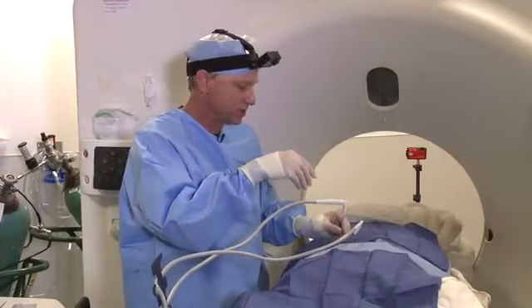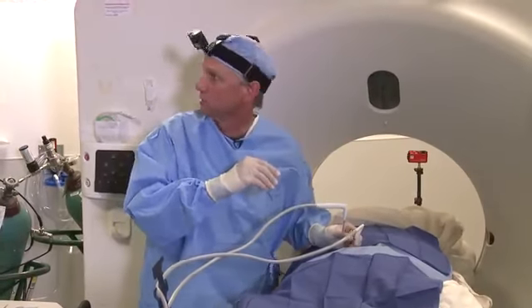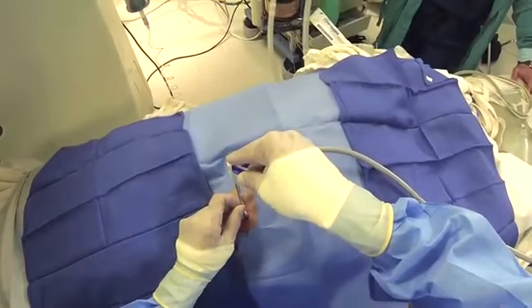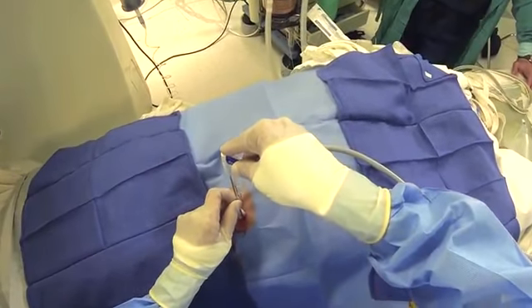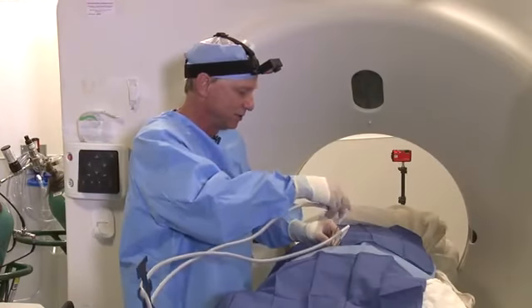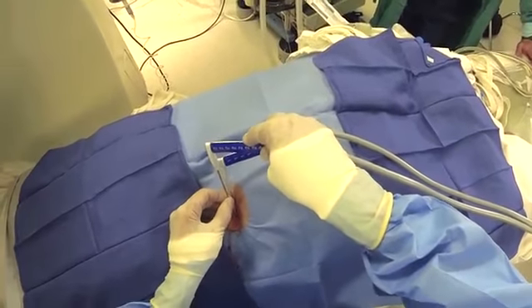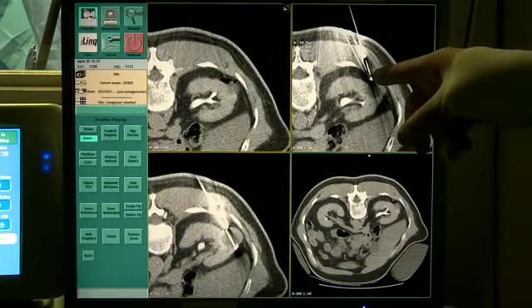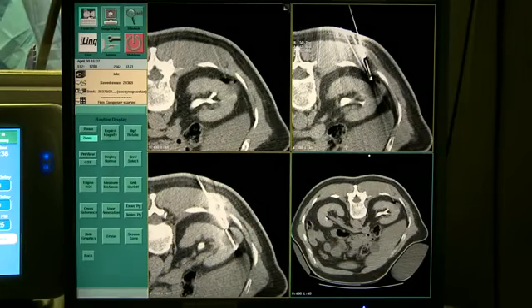So we'll reposition this into a slightly more steep projection. I'm going to pull it back. And again, not commit too deeply, but enough hopefully to hold the probe. You can see it settles back. Maybe give it another. So here's the second probe, partially readjusted. I think it still has to go lateral a little bit.